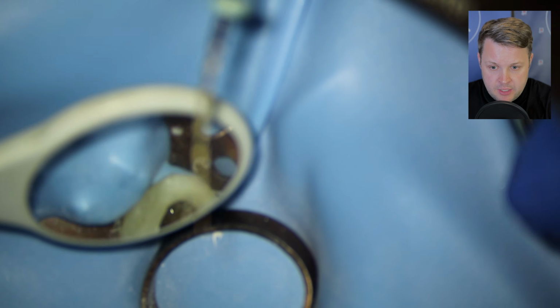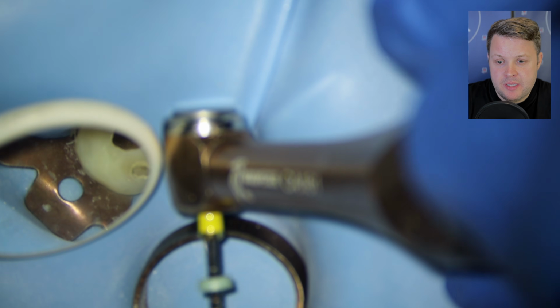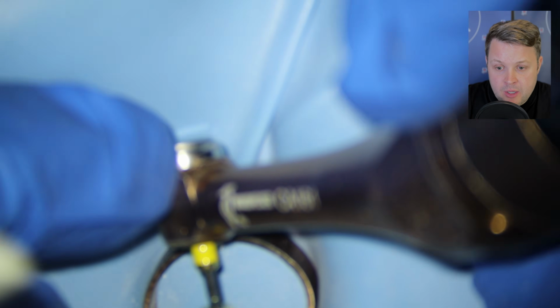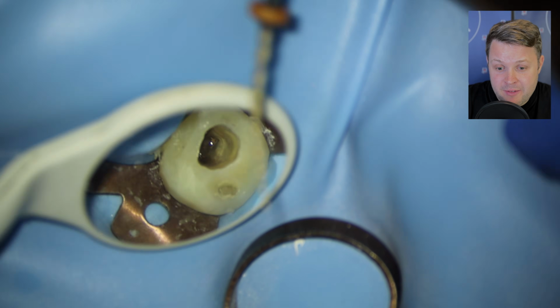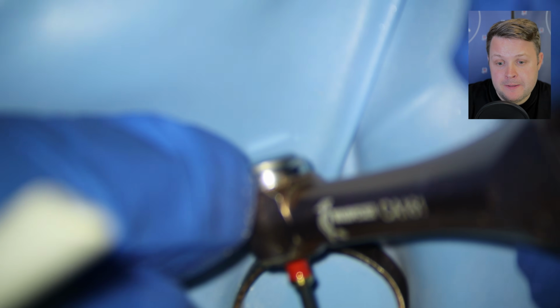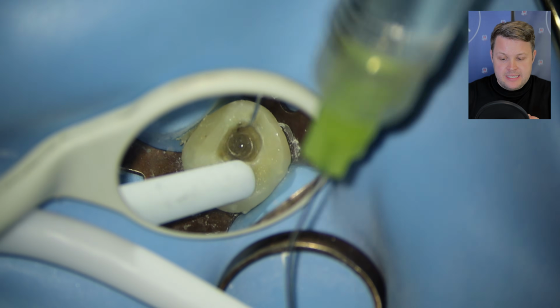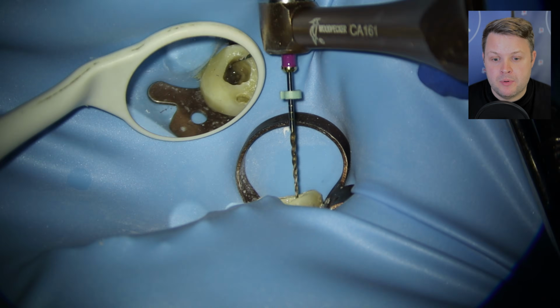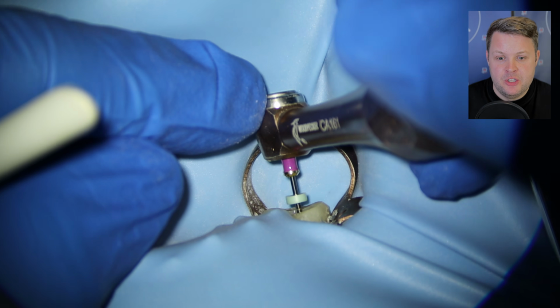So I'm going to go down the MB1, and again I'm going to use that technique with the size 20 high flex, and in this case this goes to length quite nicely. Again, if you are using this size 20 in quite a few canals, you've got to be careful about fracturing them, because these files take a lot of brunt. It might be a really good idea to inspect the ends of these files, because sometimes you can see they're unwinding, and when they're about to unwind, they're going to break. So don't be scared to get new files out.